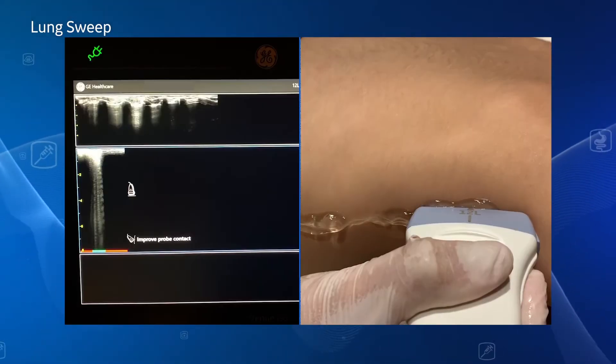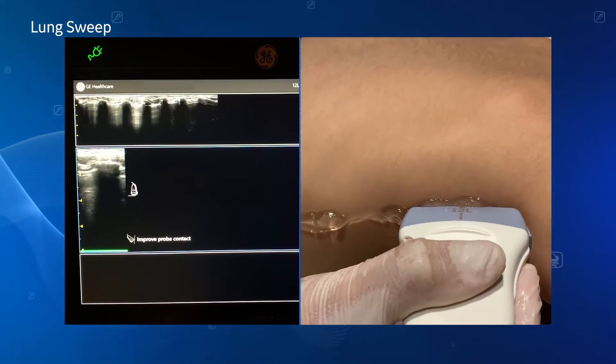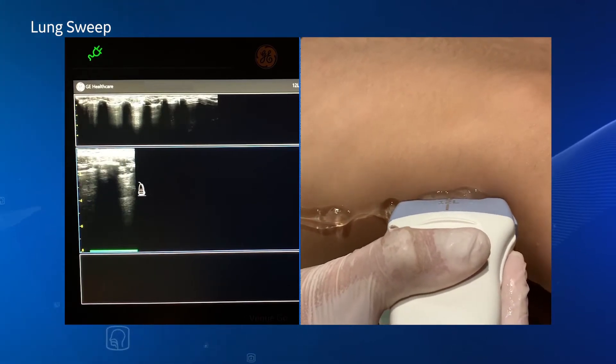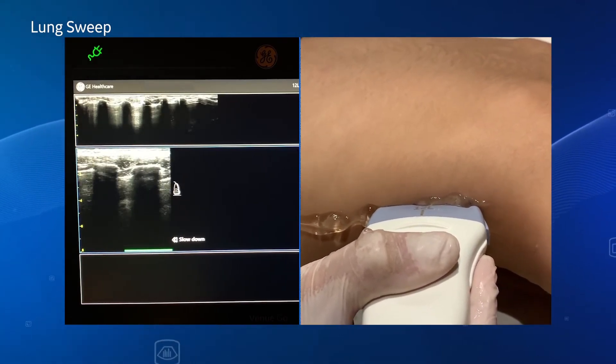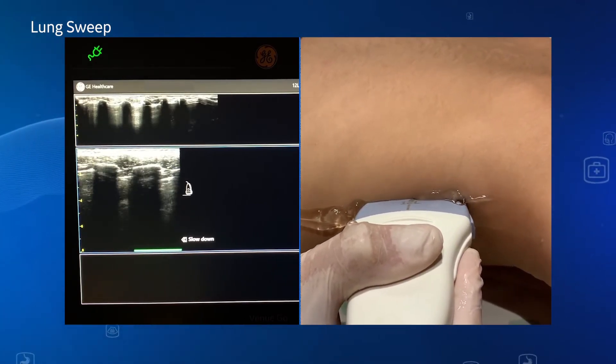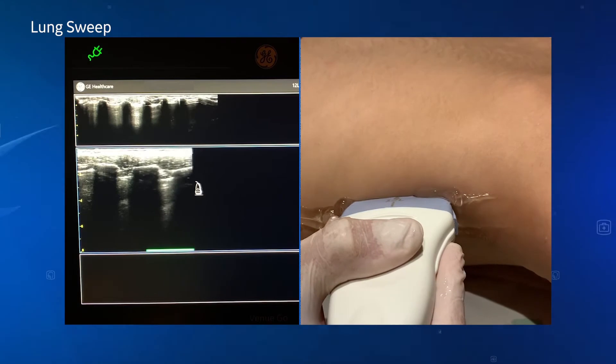There's no need to touch the screen, reducing touch points and helping your infection control efforts.